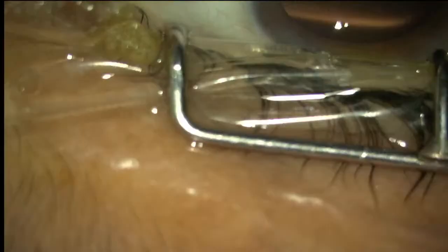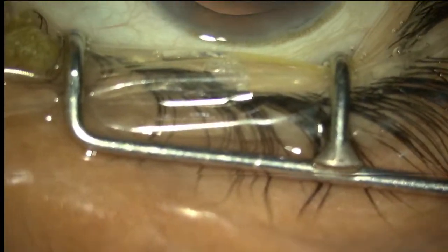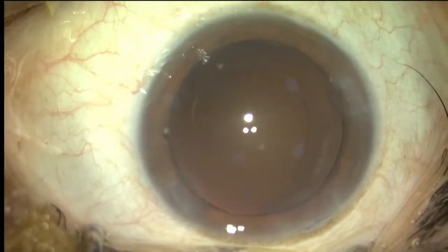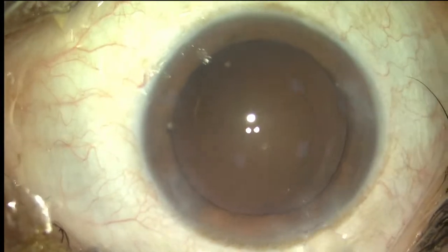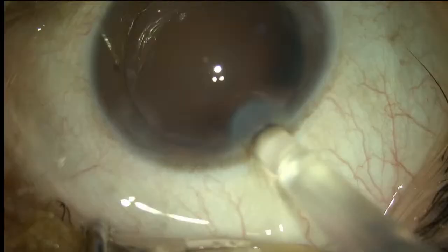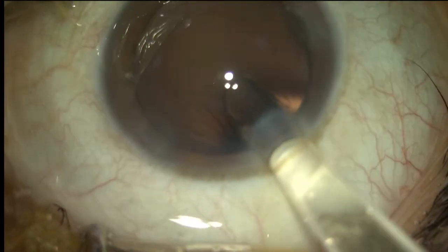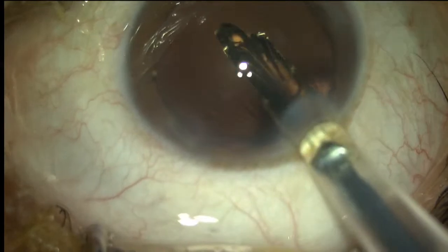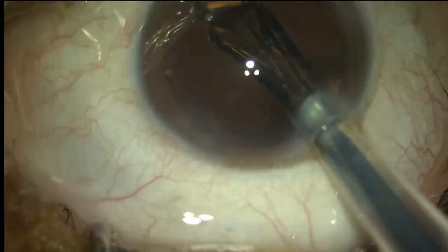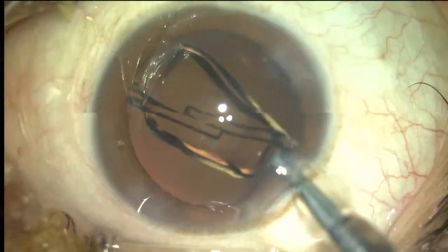So we normally aim for complete emmetropia for this IOL. I don't aim for the hyperopic or myopic side. I normally aim for the emmetropic side because this IOL has both technologies, as you said. It has EDOF technology as well as multifocal technology, a diffractive component as well as the EDOF component. So it gives you much clearer distance, reading and intermediate vision.